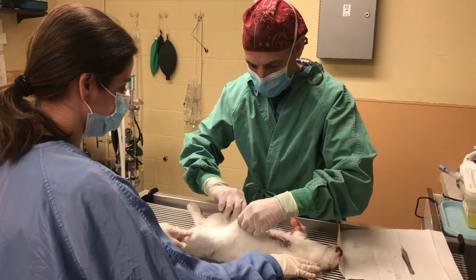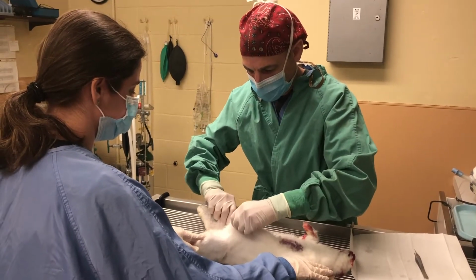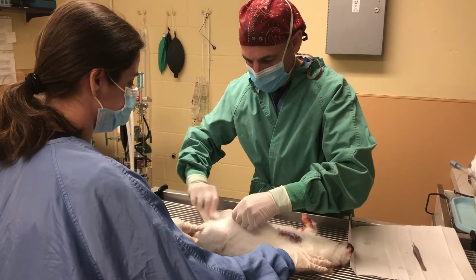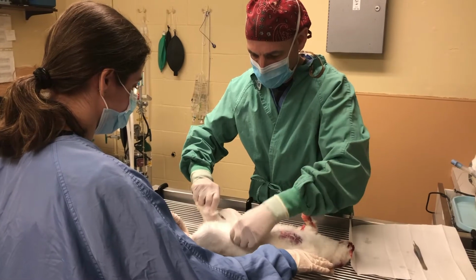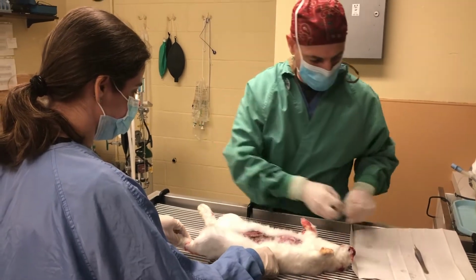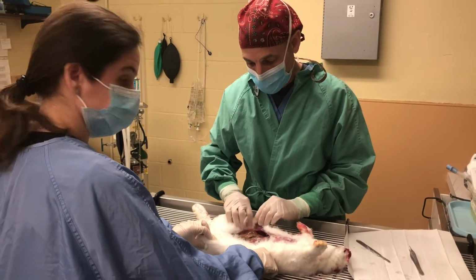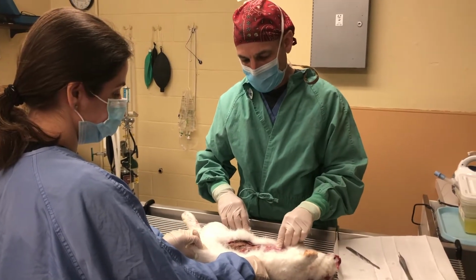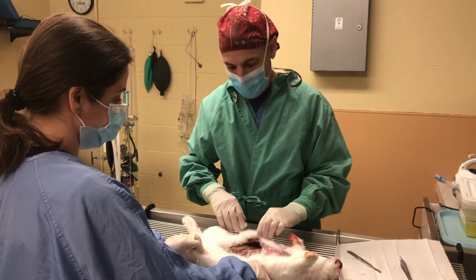An incision to get into the abdominal cavity. Okay, reveal animal's internal abdominal organs. If I also have a pair of scissors, which I'll get in a moment, we'll get into the chest cavity.